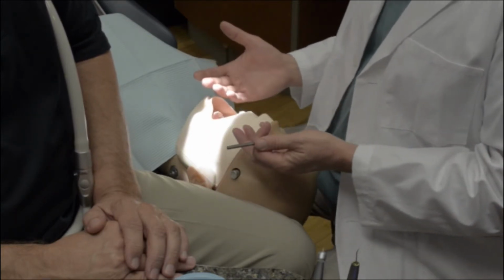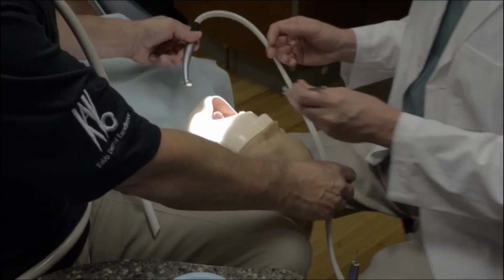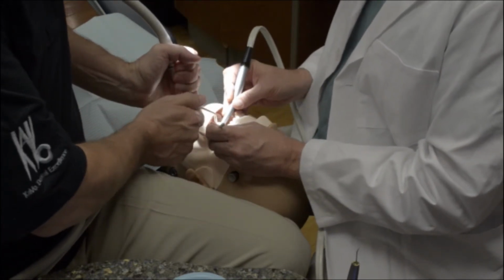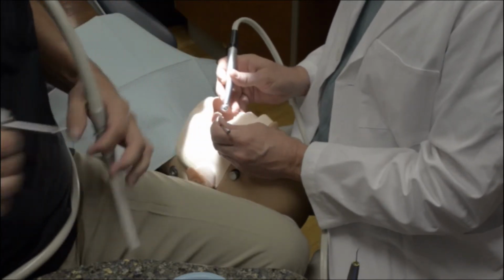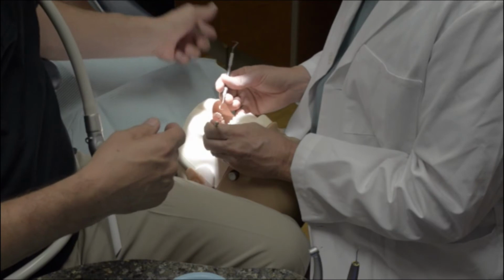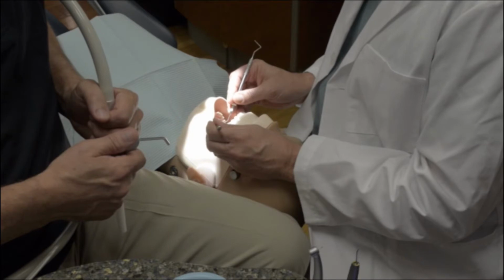So in that technique, we have a system in which the assistant picks up the handpiece and delivers the handpiece to the doctor, but the doctor has to move back and drop the cord between the patient and the doctor. Doctor takes the handpiece, and the assistant gets into position, and then the prep is cut. Once the preparation is completed, now we all have to stop. The doctor releases the handpiece, moves back, then comes back into the field to receive a new instrument and begin treating the patient again. This does take extra time and defeats some of the advantages of the ergonomic delivery.